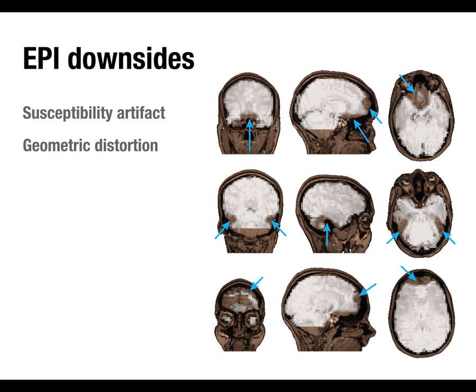The other thing that you can do is there's a different type of pulse sequence that basically maps out the magnetic field. So when you've got the person's head in there and their head is distorting the magnetic field in its own idiosyncratic way, you can run that field mapping sequence and get a map of exactly where the distortions are. And then in software, you can use that to correct for those imbalances.